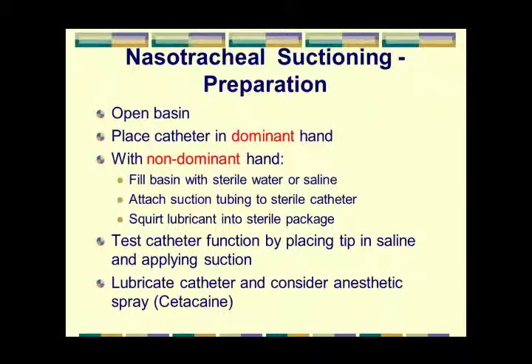The catheter will be inside a little plastic or a paper sleeve, slid in there. You're going to go ahead and reach in and grab it. At this point in time, both hands are still sterile, so it's not an issue. Throw my thing away. Now I need to fill the basin. Now I need to make sure that whichever hand doesn't have the suction catheter, and what I always do with a suction catheter is I wrap it around my hand so I can hold it in my fist.